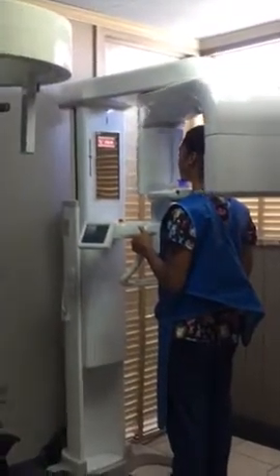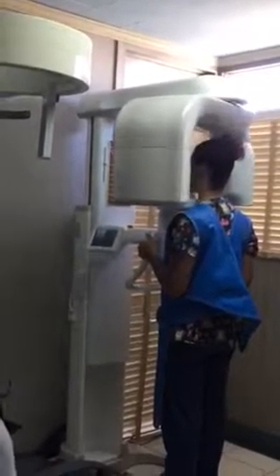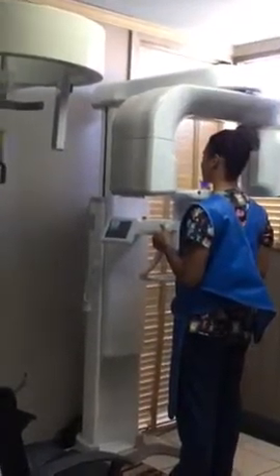Now the X-ray is on. That light turned on red over there, it says X-ray on, and there's a sign over here that says X-ray on. Usually 7 feet is the minimum distance. Okay, and now the light went off, and it says the operation is finished. You can let go. And then you come and you guide the patient out.